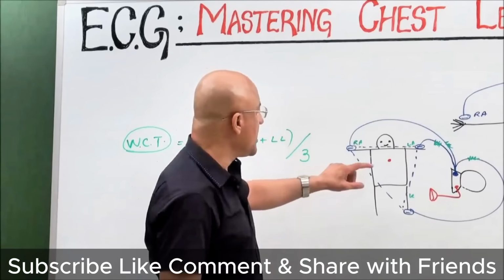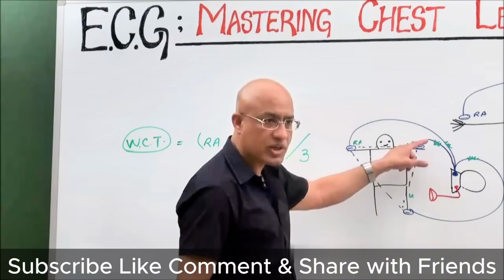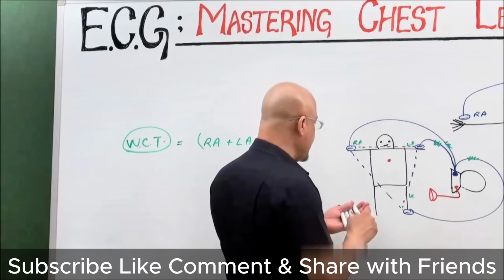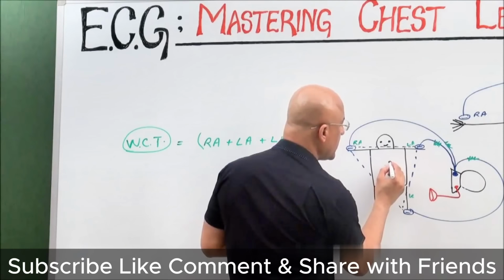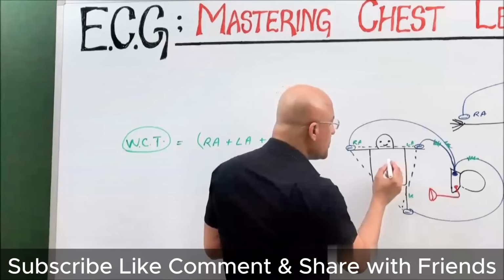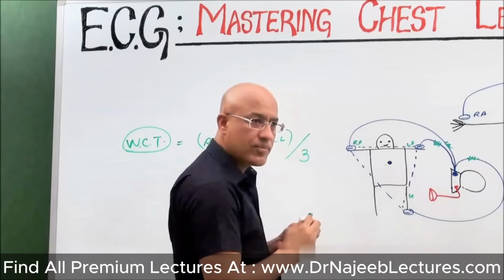That is why, when you make this kind of arrangement and connection through the negative terminal, we can say we have placed a virtual terminal at the center of the triangle, which has almost 0 potential.